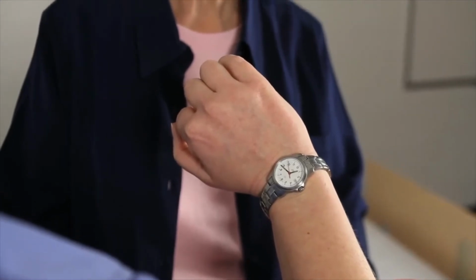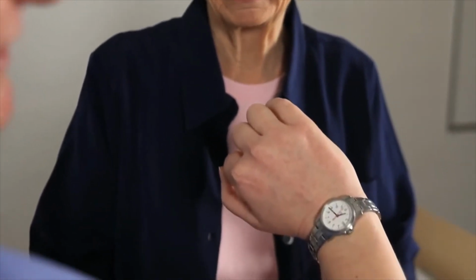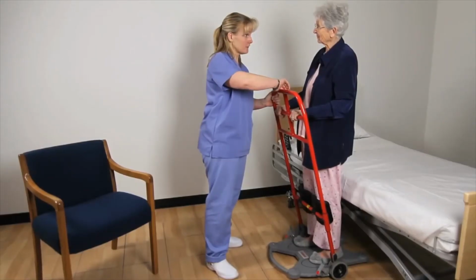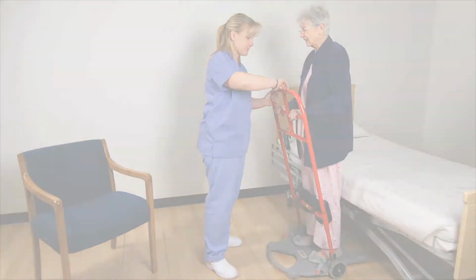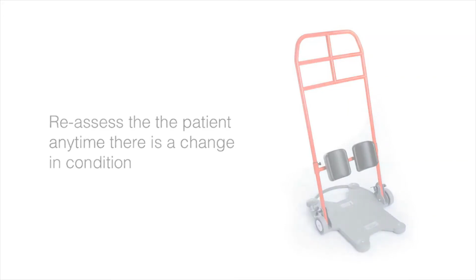Now for the final test, we want to determine how much time the patient is able to bear weight. This test is very important and not only assesses the patient's strength and ability to bear weight, but their endurance as well. This will help determine the patient's ability to walk for a certain duration of time. In this test, we will assess the maximum time that they are able to stand and bear weight. This will save time from transporting and provides the patient with a familiar environment to exercise within.